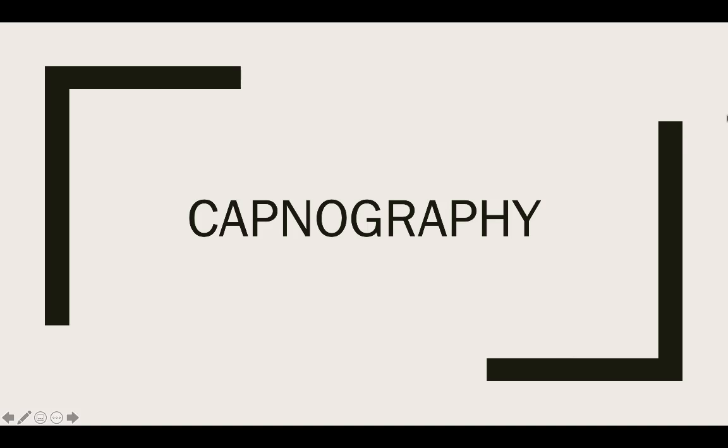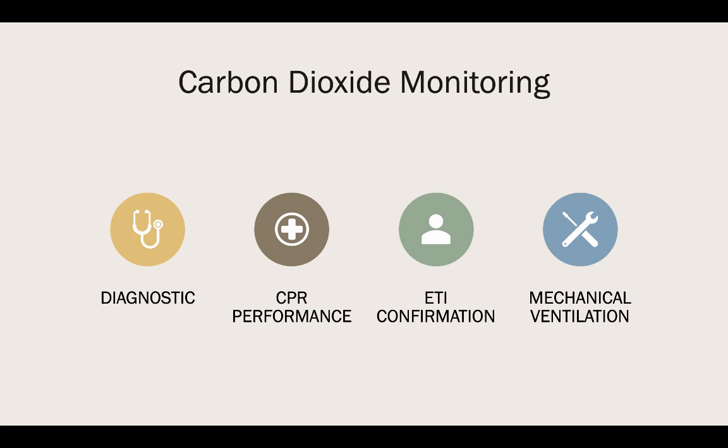Today, we're going to talk about capnography. Capnography is the monitoring of carbon dioxide coming out of your patient. So we can use this for diagnostic purposes. We can also use it for CPR performance, so knowing how well you are doing compressions.